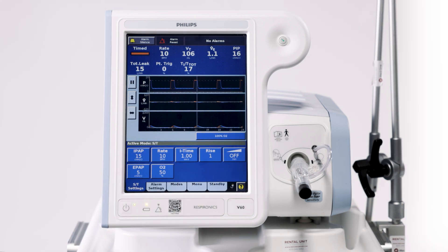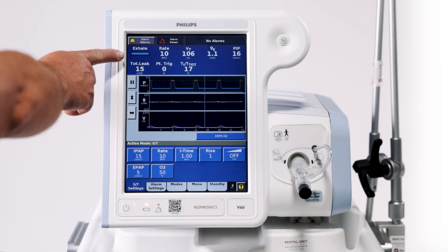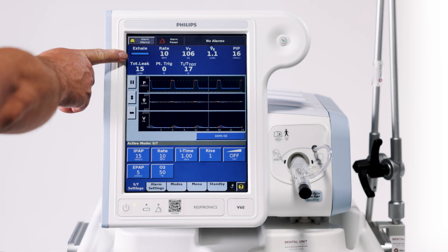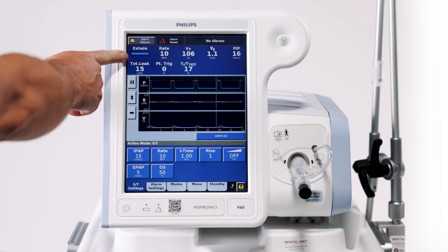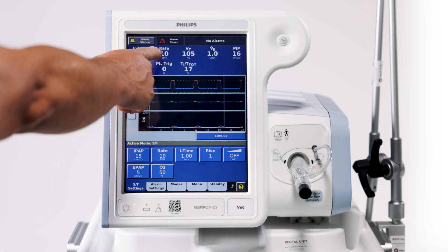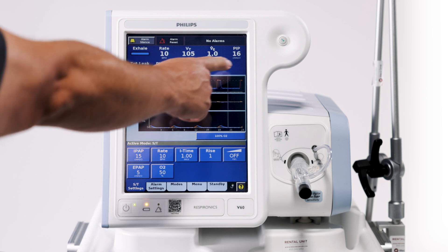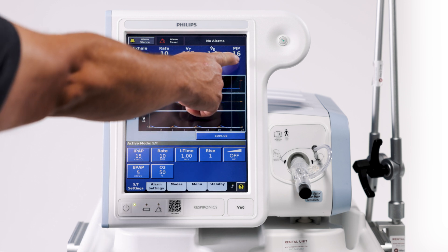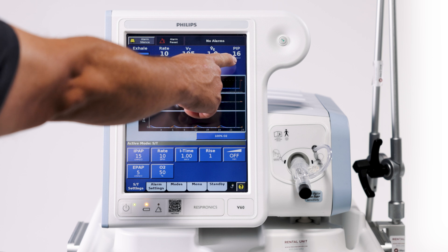We got the V60 up and running. Up here in this window is all your patient readings. A couple of key highlights are your breath rate and your peak inspiratory pressure in the corner.